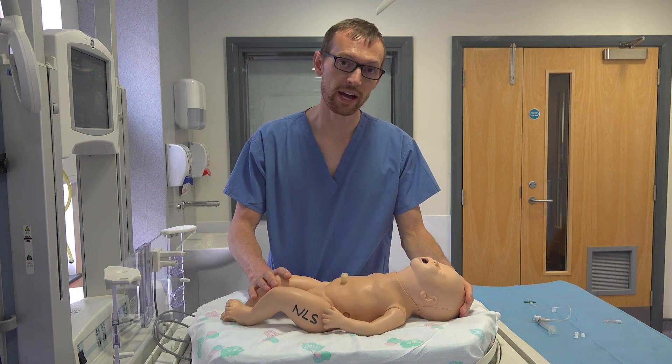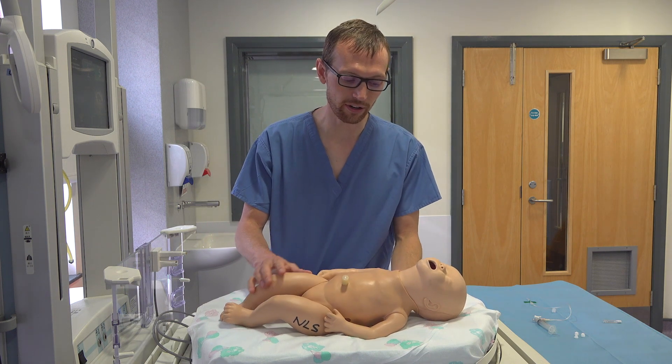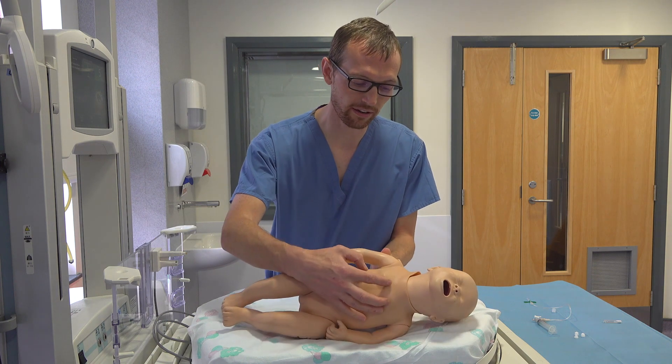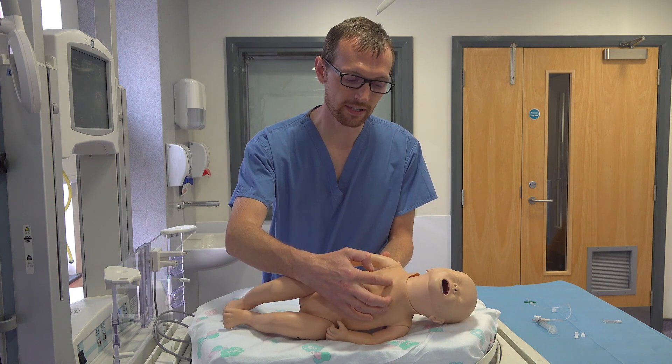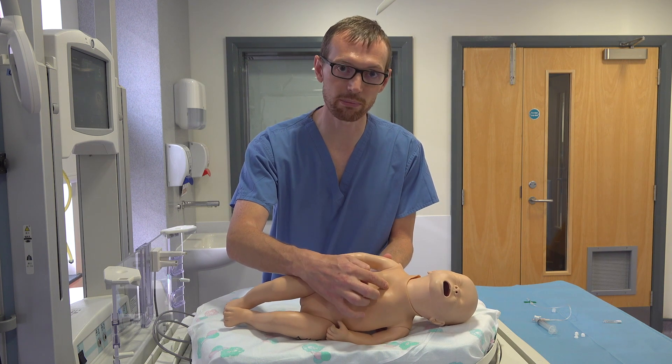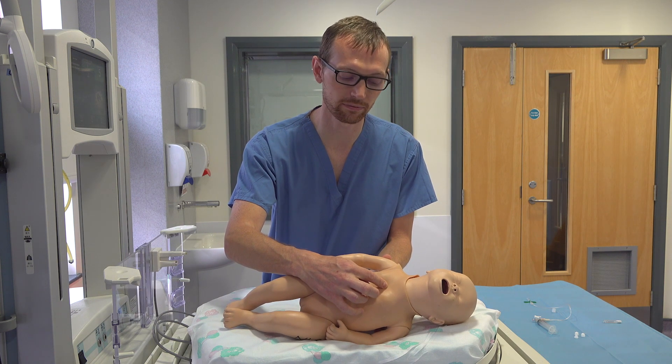Identify your landmarks for a needle decompression. It's the mid-clavicular line, second intercostal space, which is usually just above the nipple line.